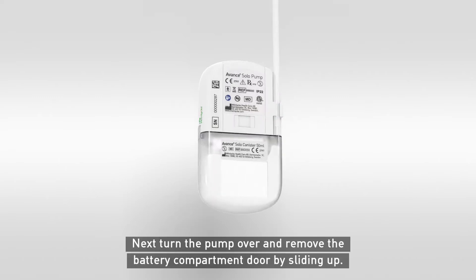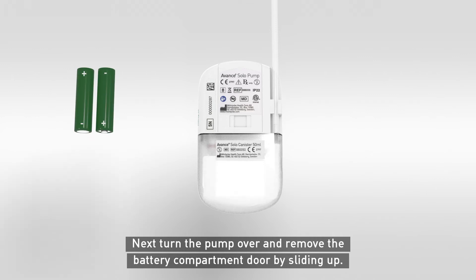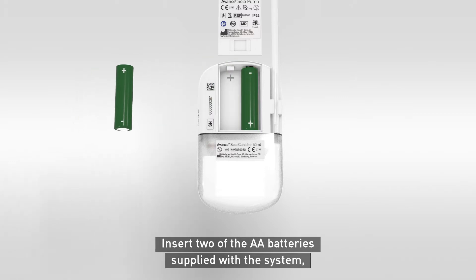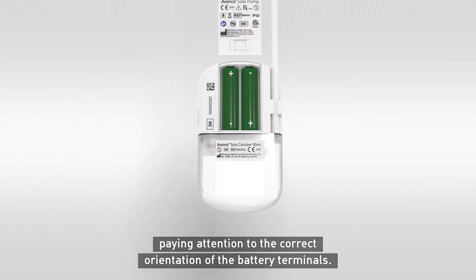Next, turn the pump over and remove the battery compartment door by sliding up. Insert two AA batteries supplied with the system, paying attention to the correct orientation of the battery terminals.